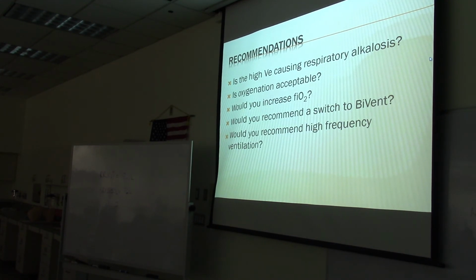Would you recommend a switch to bivent? Yes. Probably having those 5-second or 4-second inspiratory holds is going to pop open a lot of atelectatic alveoli and improve the oxygenation. So yes, you'd recommend switching to bivent. Would you recommend high frequency ventilation? Yes. Severe oxygenation defect is a reason to use high frequency ventilation.